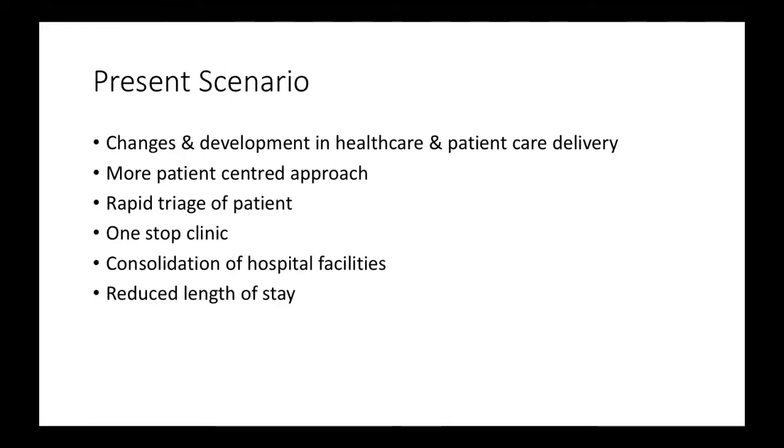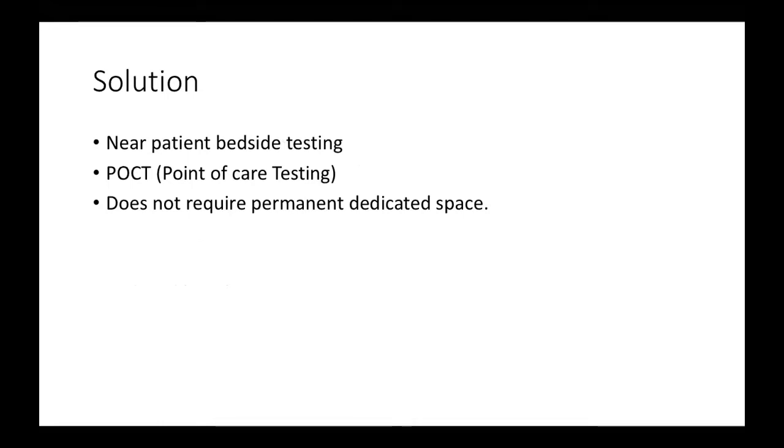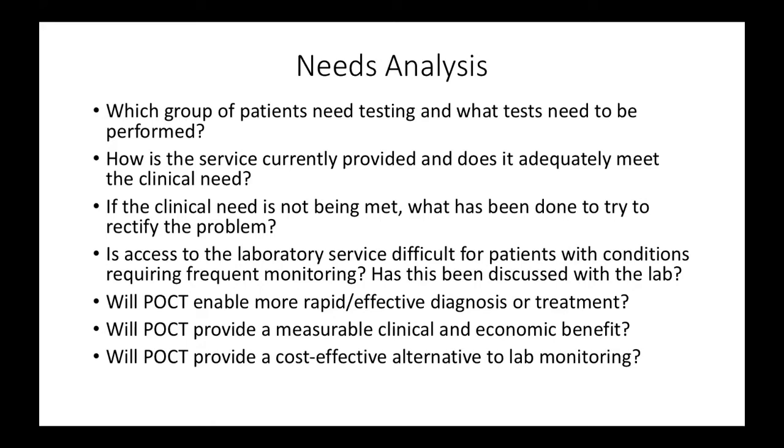Now for this present scenario, how can we fulfill this? If we can perform certain tests close to the patient, or you can say bedside testing. This is also known as point of care testing, and this doesn't require any permanent dedicated space. You keep equipment in one place, and most of these handheld devices you bring close to the patient and perform tests. Immediately you get the result, and you take appropriate action. But for this, we have to understand.